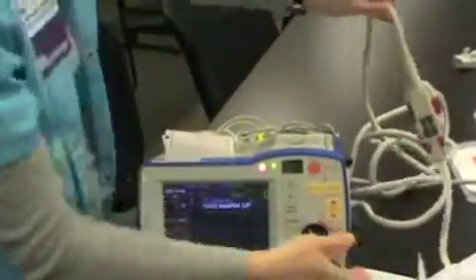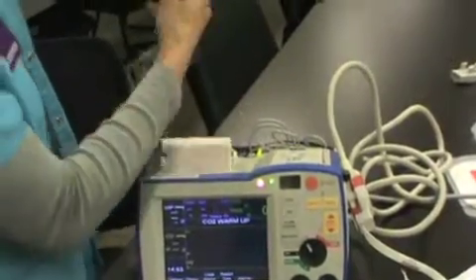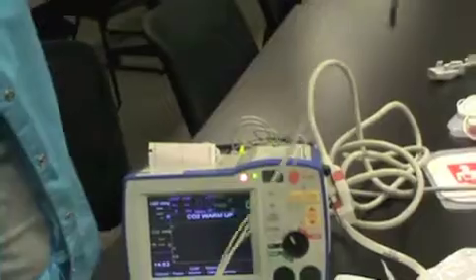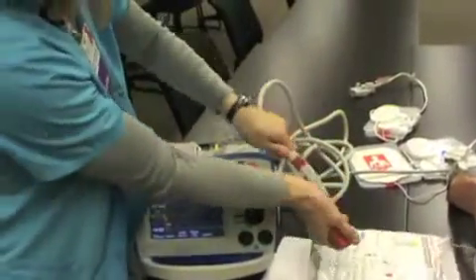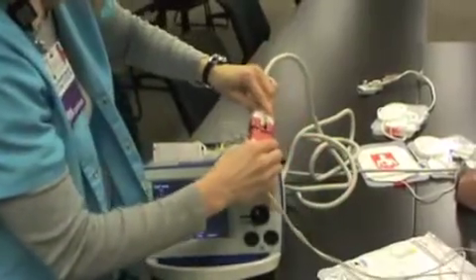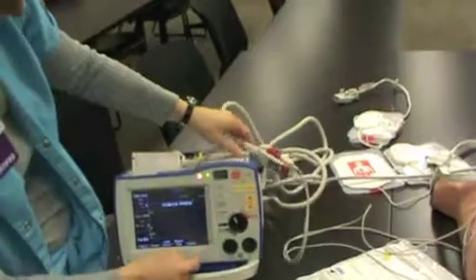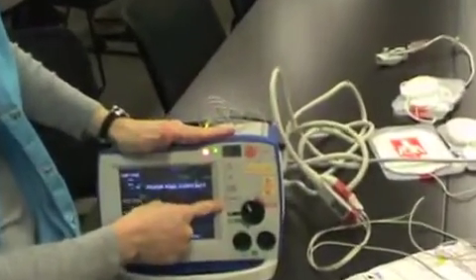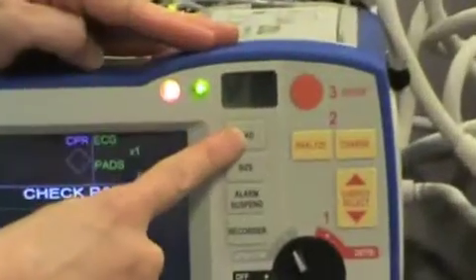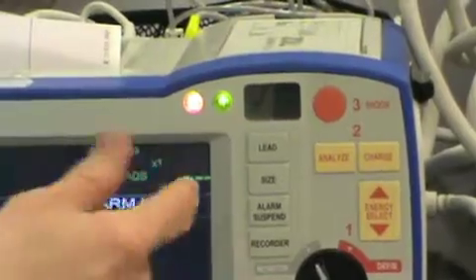Instead of using the pads though, you would want to use just a 3-lead EKG. So that cable is back here in the little net holder, and you would just plug those into your patient there and plug your therapy cable. Check pads. So that is how it would be configured for just the monitor. Some buttons you might need to use while you're monitoring are here to change the lead. If you're not using the pads, it comes on automatically to look for the pads.